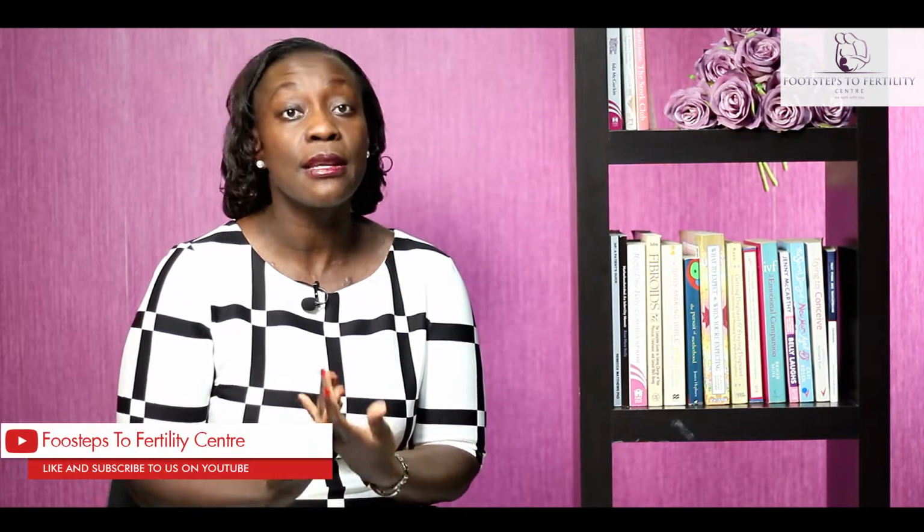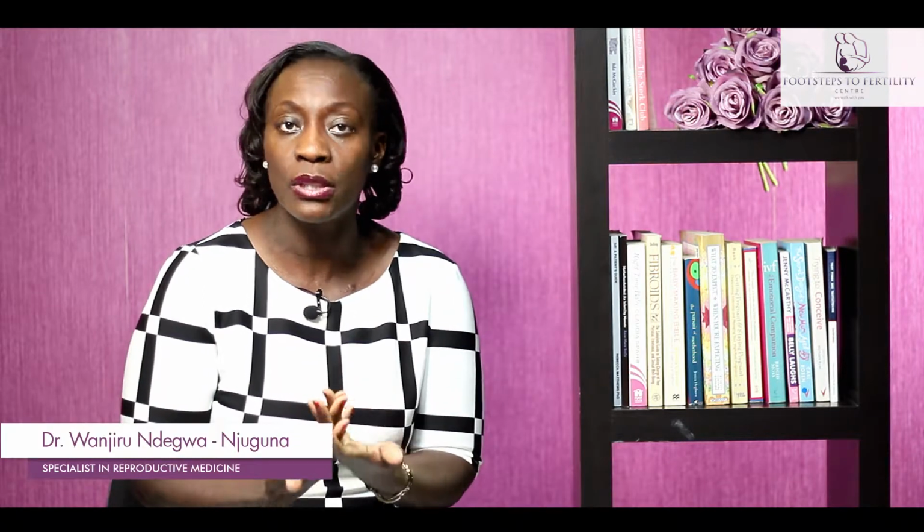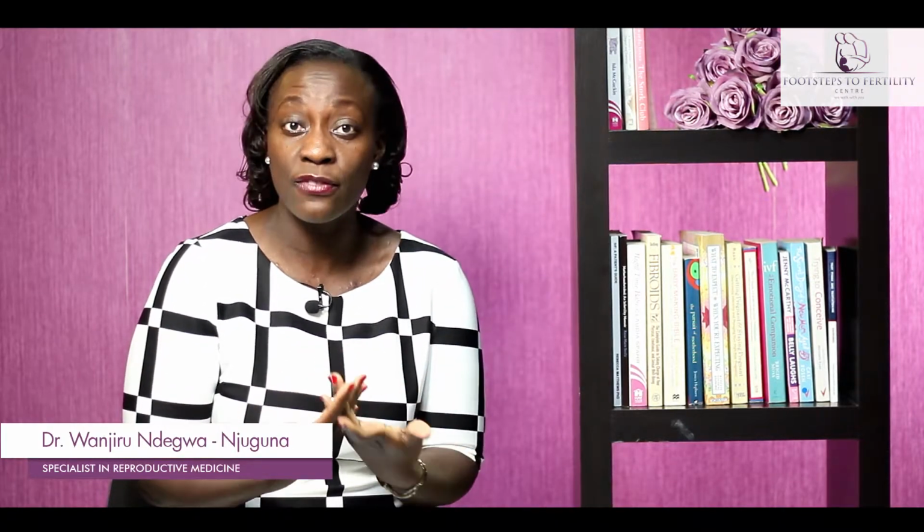We also do it sometimes before IVF because it has been shown to have beneficial benefits for doing it before IVF. We see that sometimes the rates of implantation, rates of pregnancy are much, much higher after you do a hysteroscopy. So don't be afraid of hysteroscopy. It's really non-invasive. We go in right through the cervix, so there are no scars for hysteroscopy. It's really quite a simple surgery.